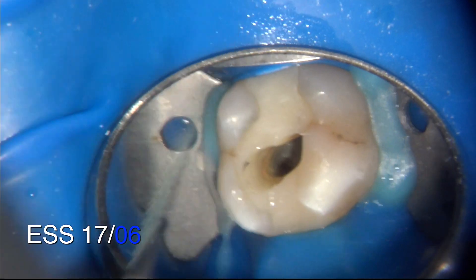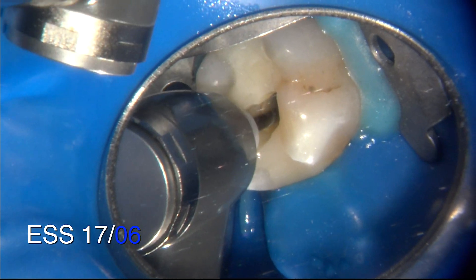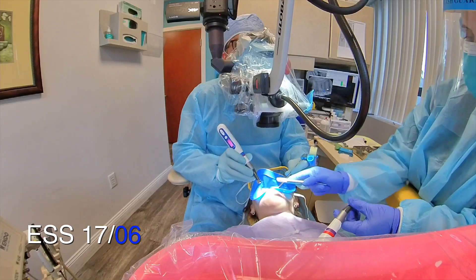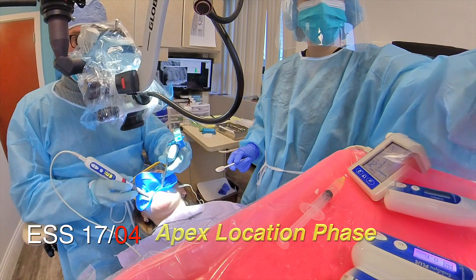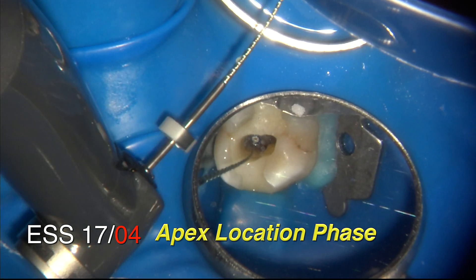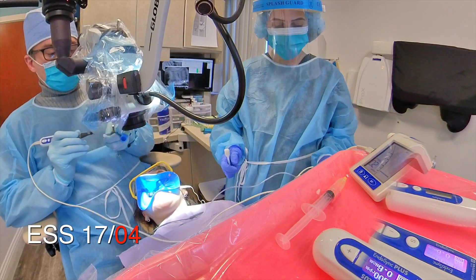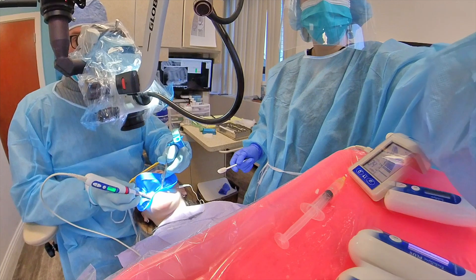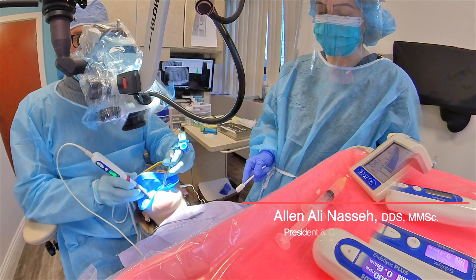After coronal shaping using files of larger taper and smaller tips in hybridization taper protocols described in previous videos, I dry the chamber completely, leaving just a little fluid inside the root canals for better conductivity and measurement. I switch to Endosync Plus connected to Endosync AI and use my Scout 17/04 taper for working length measurement. As the file achieves length it comes to a stop because apical stop action is on. The assistant adjusts the stopper to the reference point, I remove the file, measure, and capture the working length using my endo ring, then disconnect the apex locator and use that length for instrumentation.